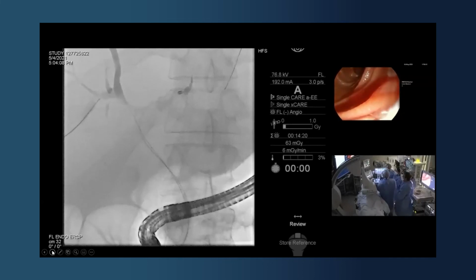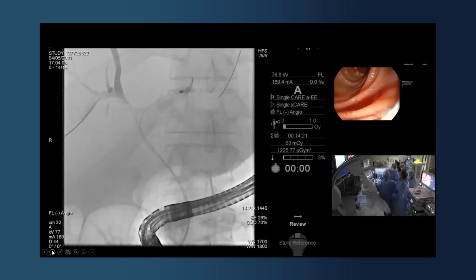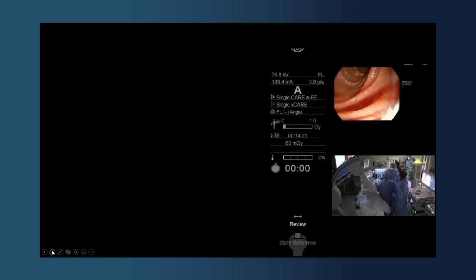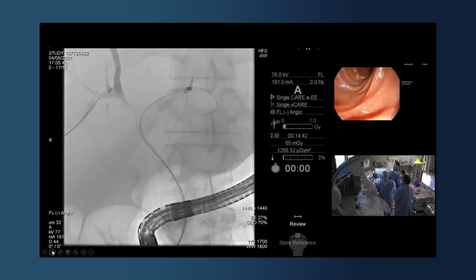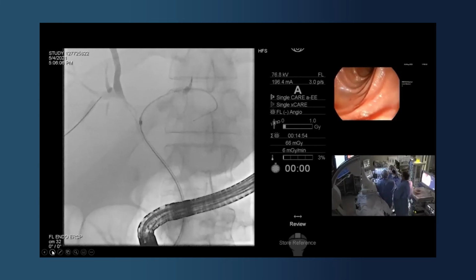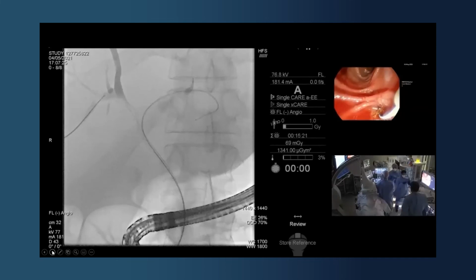Beautiful. Right, good. Okay, now, you hold that white tube like your life depends on it, and you pull that wire out. Now, let's have the super stiff. Now, you need to be very careful with this, because if it kinks, we're even more stuck. This may not make a difference, but... screen, please. Yes, perfect. Now you need to put bridge hard up as soon as you're out.